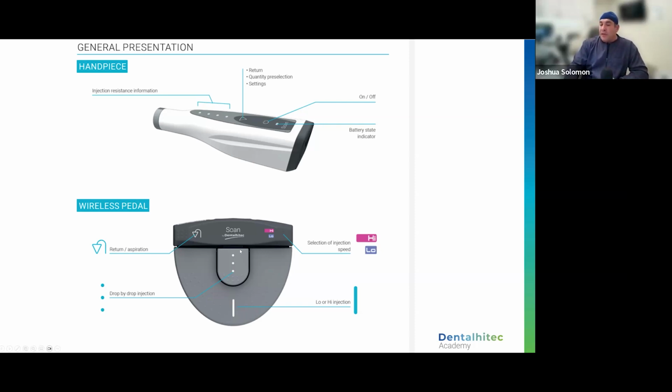Okay. Big pedal and small pedal. One important point is you really need to step in the middle of this pedal. When you situate yourself and you sit, if you place your foot and you're not directly on the middle of this pedal, sometimes I have noticed where I hear a click, but it doesn't engage.